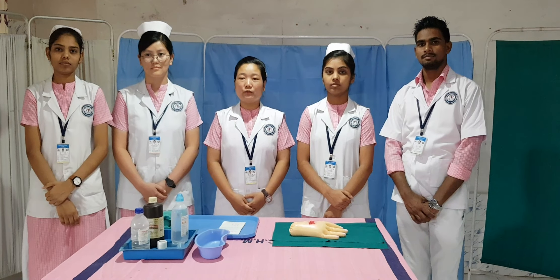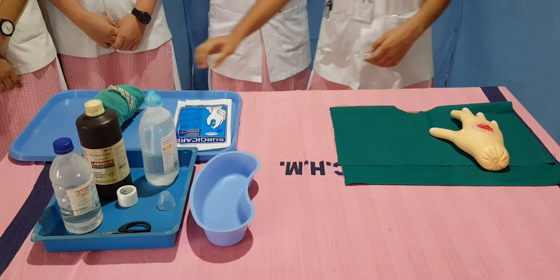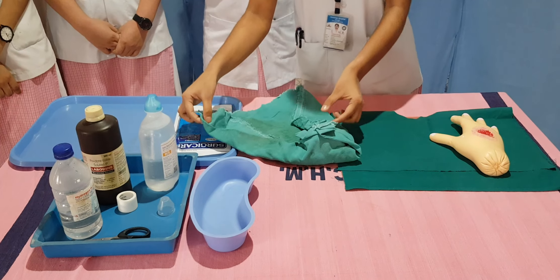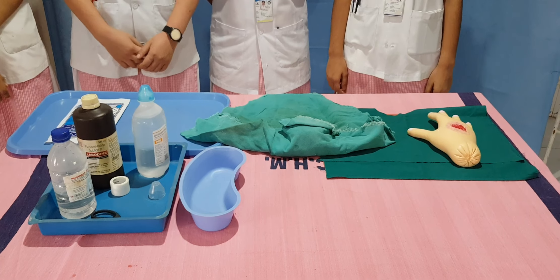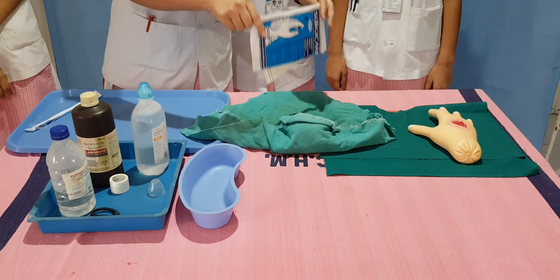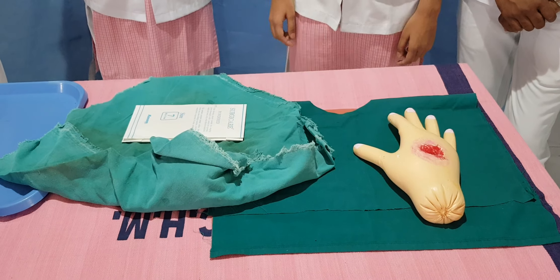Now we will show you the wound dressing procedure on our simulation model. We will open the dressing set, then open the gloves. We will do hand washing, and after that we will put on the gloves.